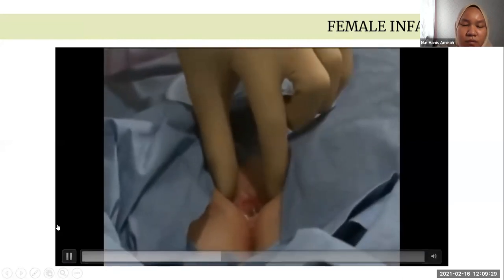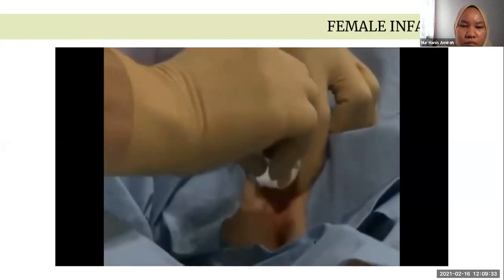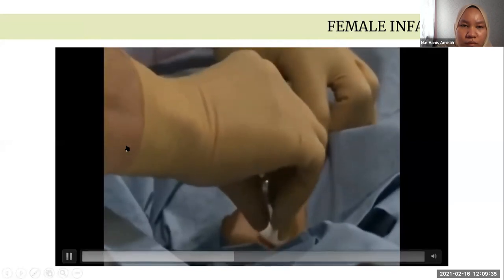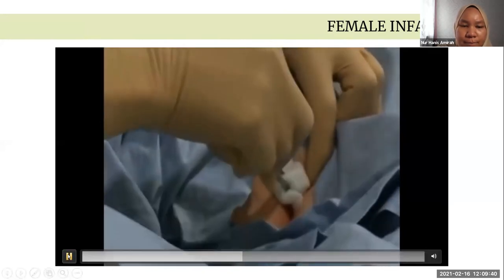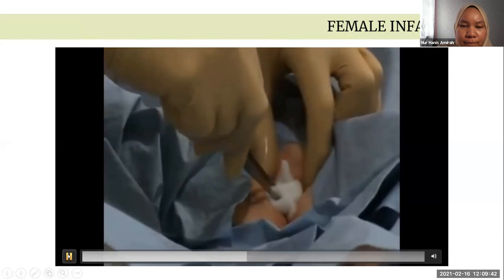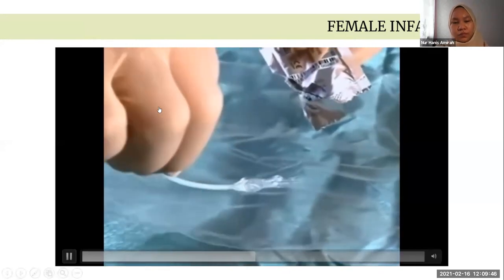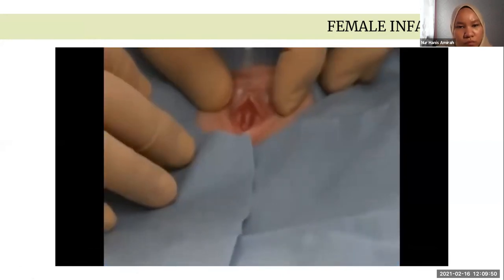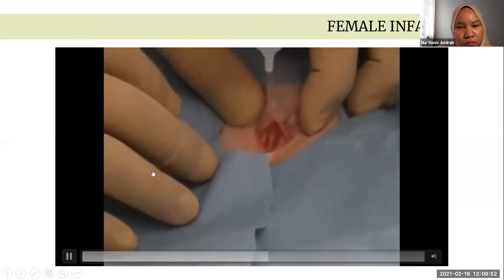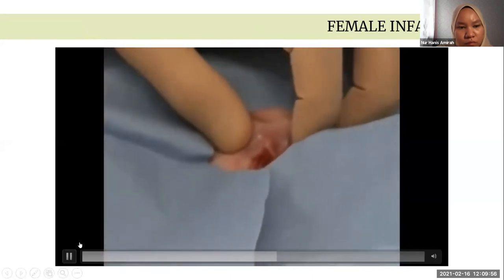Separate the labia, which are considered to be non-sterile. With your dominant hand, use antiseptic-soaked sterile swabs or povidone iodine swab sticks to wash the urethral meatus 3 times in the anterior to posterior direction. At many pediatric centers, lubricant gel is placed on the catheter before the procedure is performed. At some centers, clinicians also use 2% lidocaine jelly placed above the vagina prior to the catheterization.